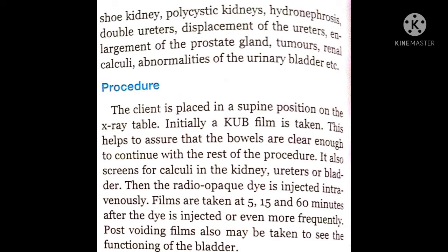Then the radio-opaque dye is injected intravenously. Films are taken at 5, 15, and 60 minutes after the dye is injected, or even more frequently. Post-voiding films also may be taken to see the functioning of the bladder.